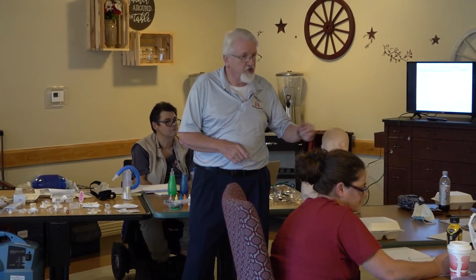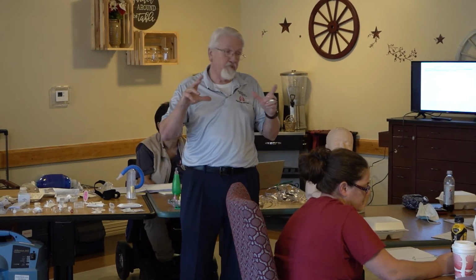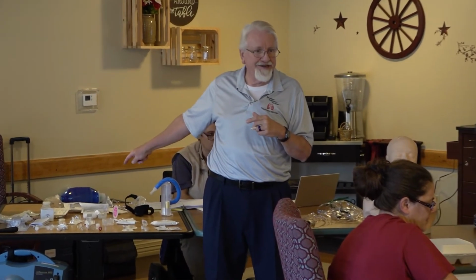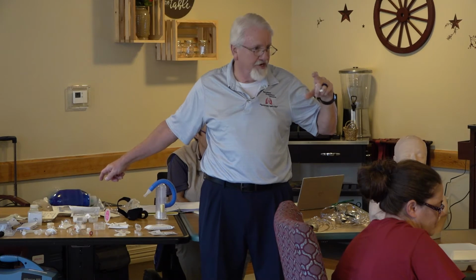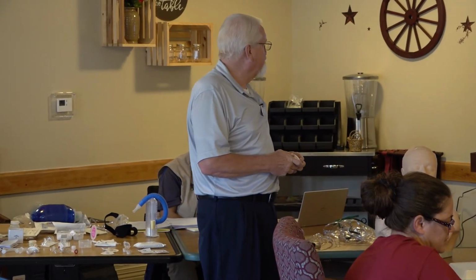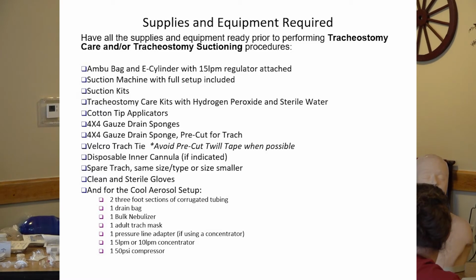If you do end up with a trach like this that you have to clean the inner cannula, what I suggest is you go to YouTube and put in cleaning trach or cleaning tracheostomy, and there are about 14 or 15 different pretty good videos on that. The reason I suggest doing that is because almost all of them use a different kit. So with your particular kit, you might have to remember to carry your little bottle of sterile water, or you may not. Your kit may have the little pack and you're good to go. So that's the only reason that I recommend the YouTube videos.